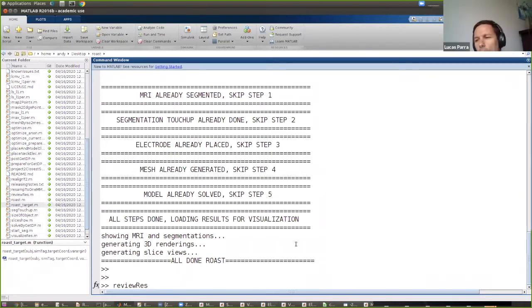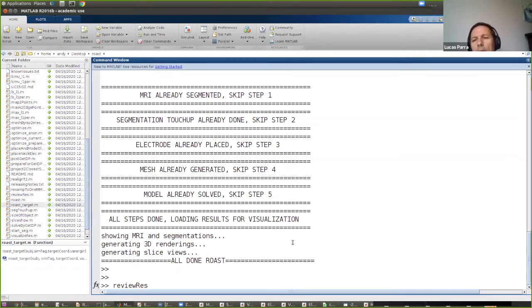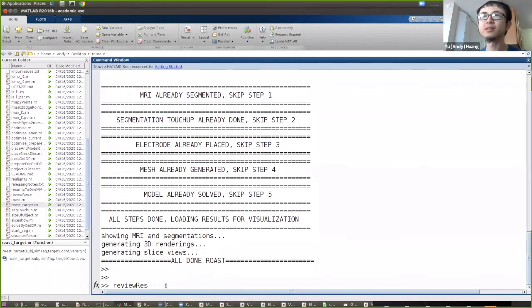The way to think of AC is that what ROAST displays is the magnitude of the field. So whether it's oscillating at 10 Hz or is a constant current, when you show the magnitude it's identical for both. This is a fairly accurate assumption for low frequencies. From a modeling perspective, TDCs and TACs produce the same electric field strength — that's why there is no specific mechanism for frequency.